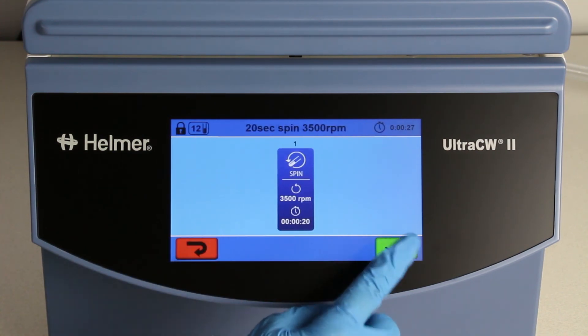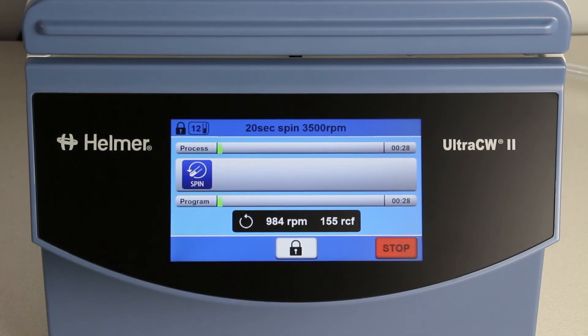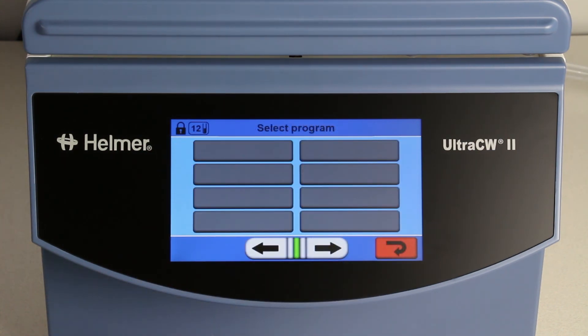These pre-installed programs are provided for your convenience. If you choose to use these programs, they should be validated to ensure that they meet your facility's needs. Users can also create up to 17 of their own programs. Please see the intuitive programming video for a demonstration.